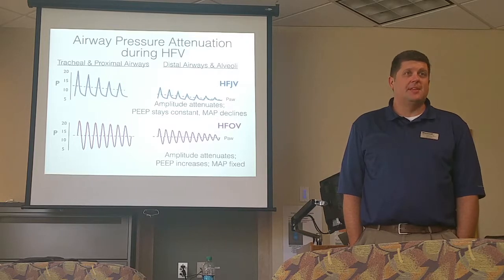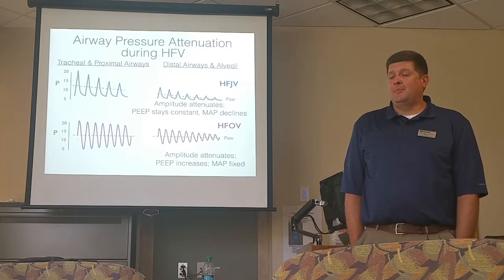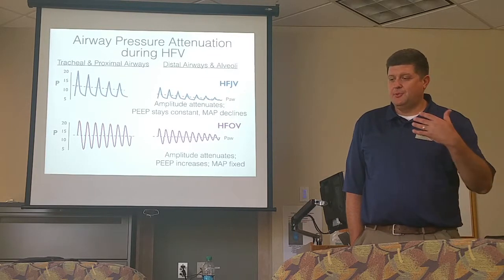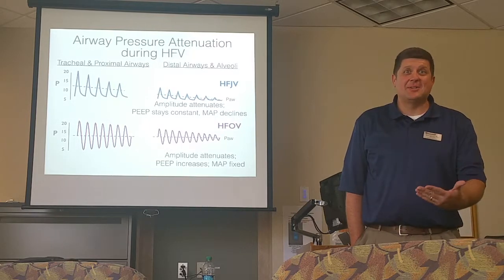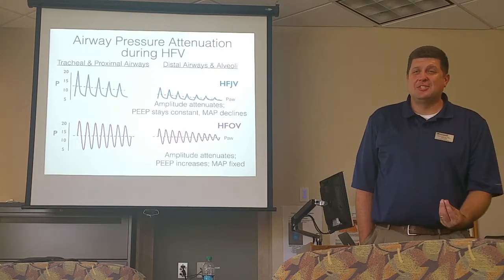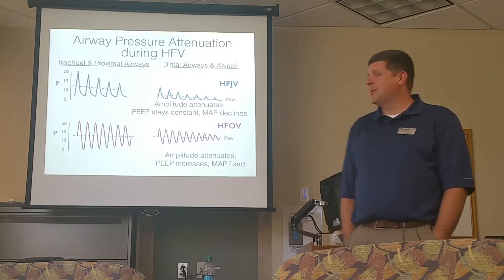They're both high frequency. There's a lot of similarities between the two. They both should be used early. They're both great used preventatively, prophylactically. They have a little 25, 26 weeker. We need to be as absolutely gentle as possible. Perfect type babies to place on either a jet or an oscillator.